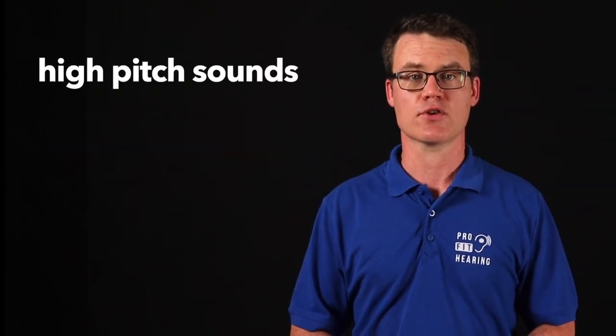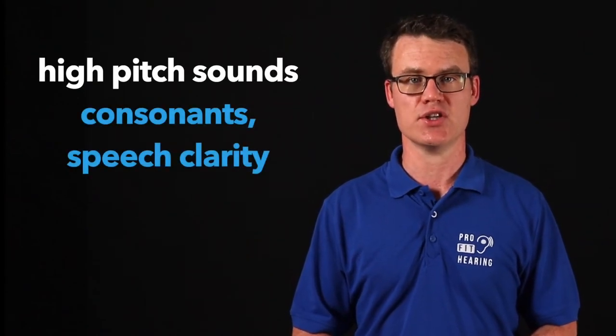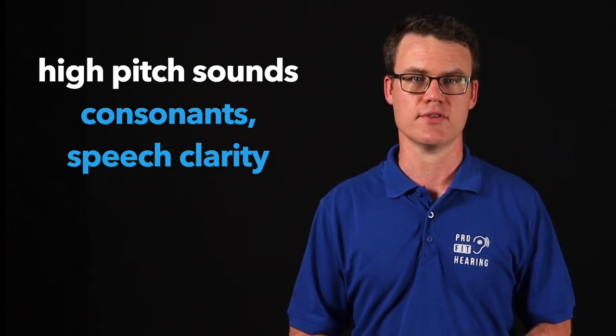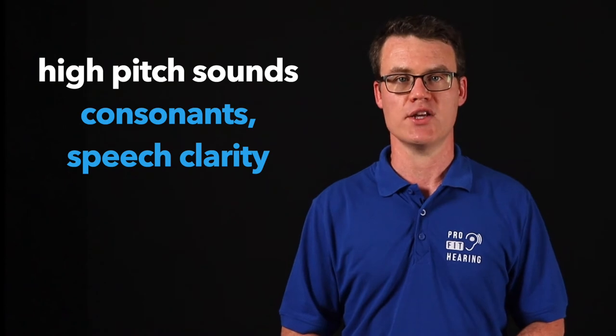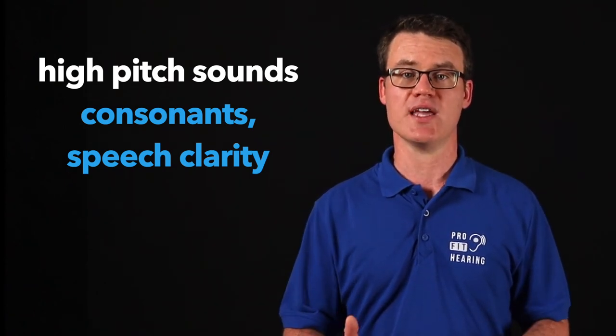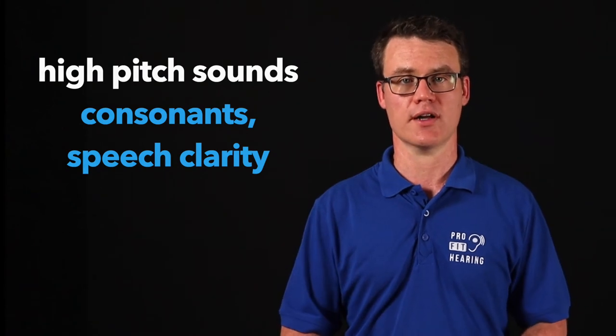Hearing loss in the high-pitched tones can significantly impact the ability to understand words, especially in background noise. High-pitched sounds correspond to the consonants in speech, and these sounds provide the fine detail and understanding of words. Hearing loss in the high-pitched range makes it difficult to understand what people are saying. The other person may be speaking loud enough, but their words just aren't clear.